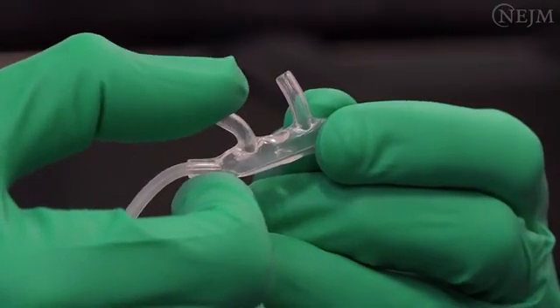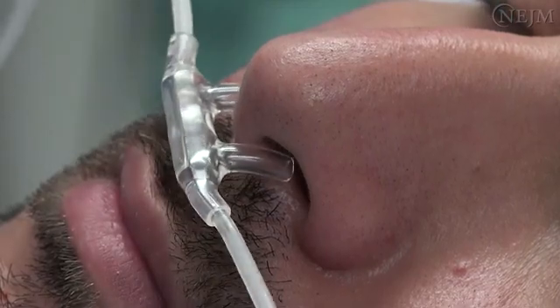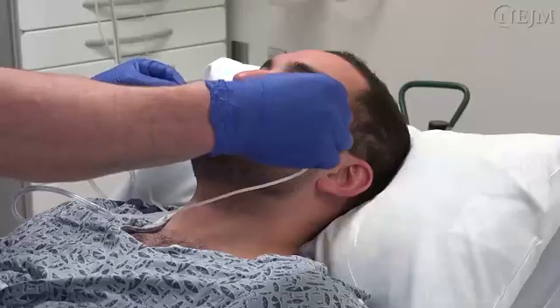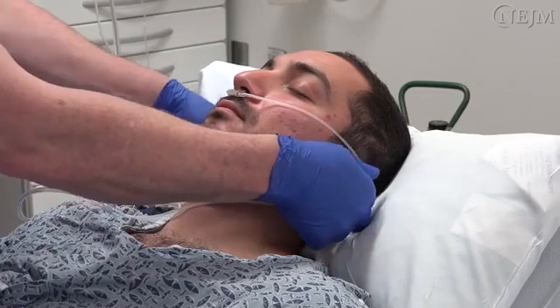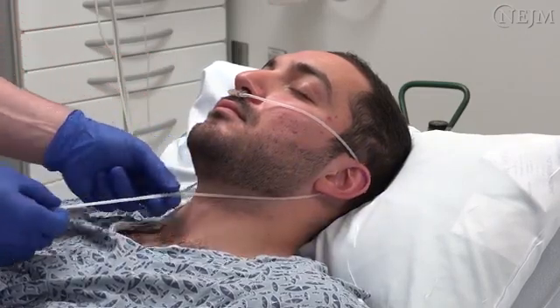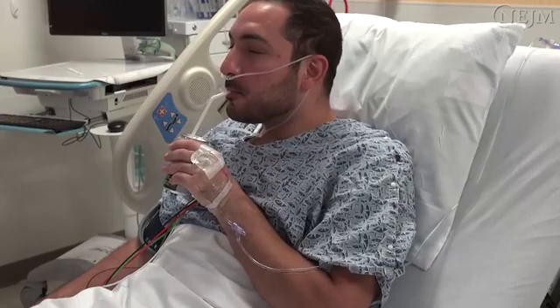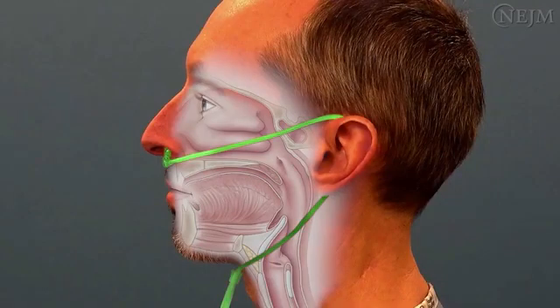A nasal cannula is a flexible tube with 2 soft prongs that are inserted into the patient's nostrils. It is lightweight and can be used at the hospital, at the patient's home, or elsewhere. The tubing is usually looped behind the patient's ears and then brought in front of the neck. A sliding toggle is adjusted to secure it in place. The main advantage of the nasal cannula is patient comfort, including the ability to easily speak, drink, and eat with the cannula in place.